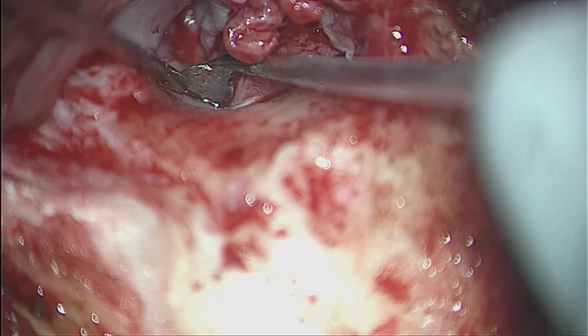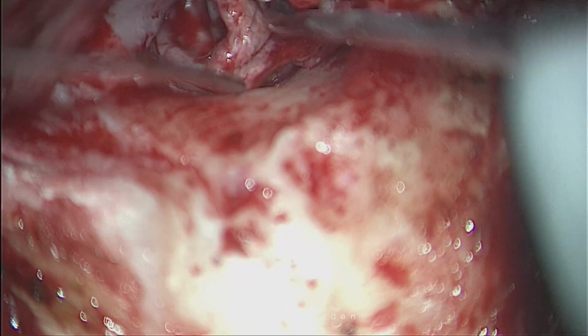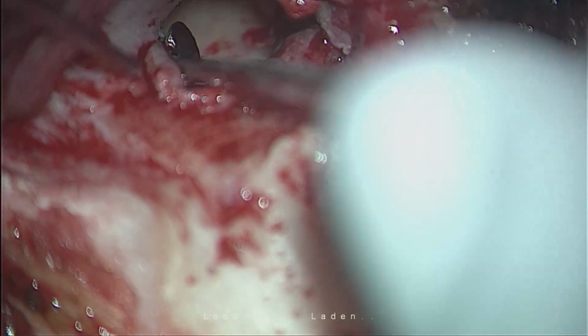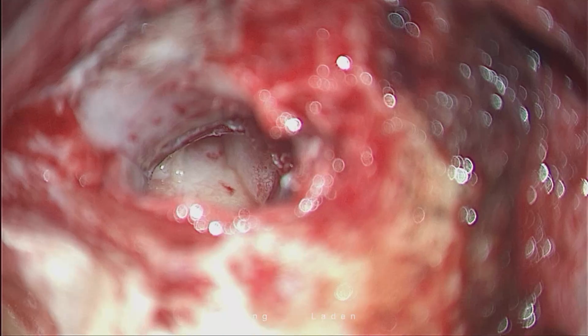See this posteriorly, the annulus, everywhere. Now if I reposition it, you can see all around the annulus is exposed, and if I reposition, this is the same perforation.